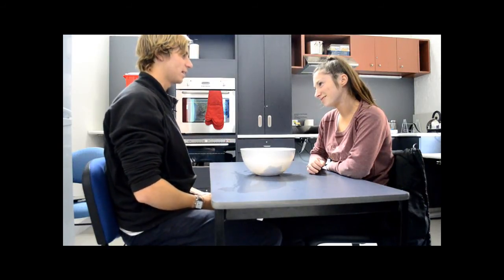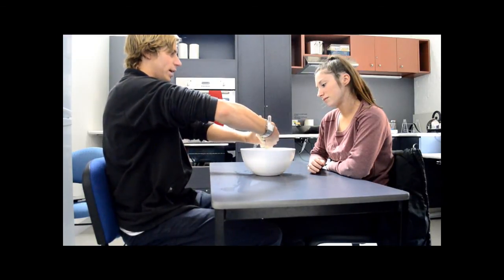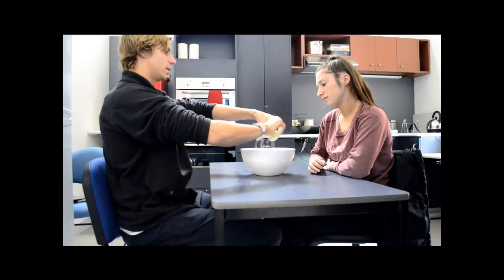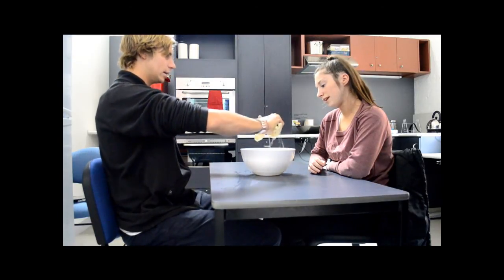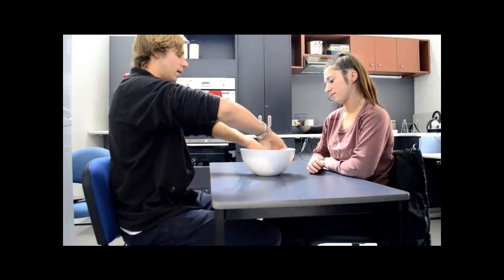Okay, Norma, for our next activity, what I want you to try and do is to pick up this washcloth and wring it out using a twisting motion. See how my hands are twisting like that? Yeah. That's what I want you to try and do. There we go. Have a turn at that.